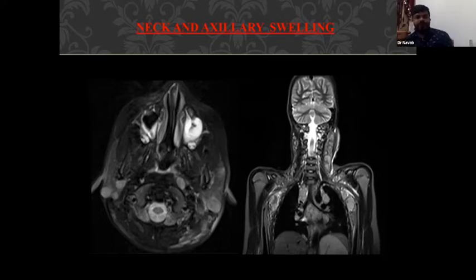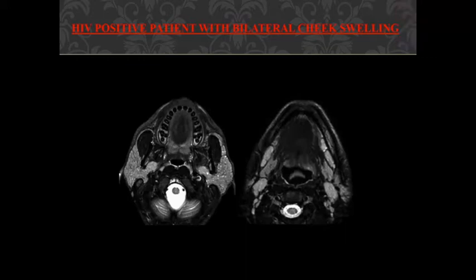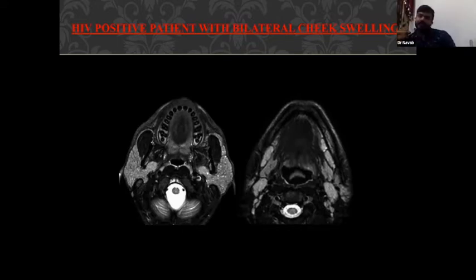Okay, sir. So next case. This is an HIV positive patient with bilateral cheek swelling. What is the HIV manifestation? HIV parotitis. Then you already mentioned for differential, benign lymphoepithelial lesions of the parotid.